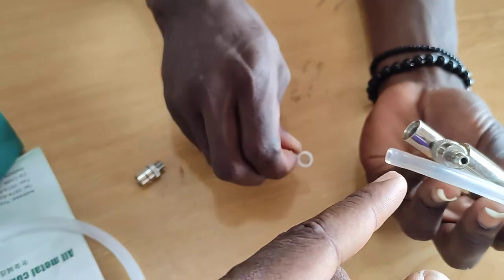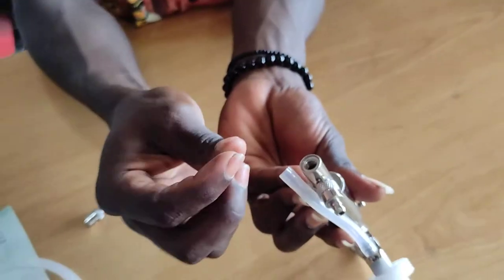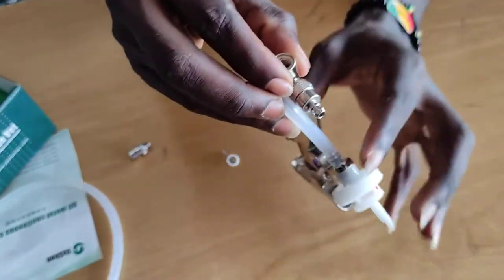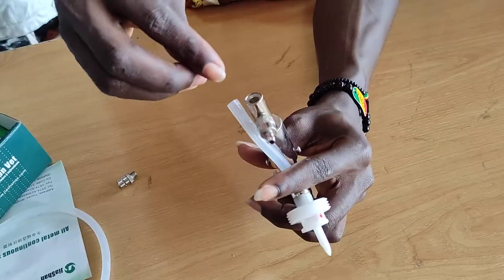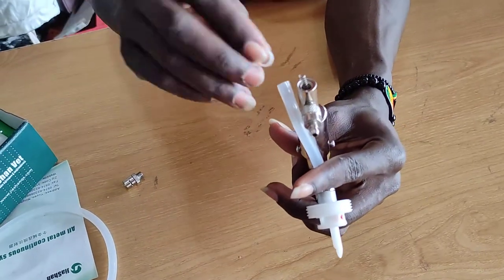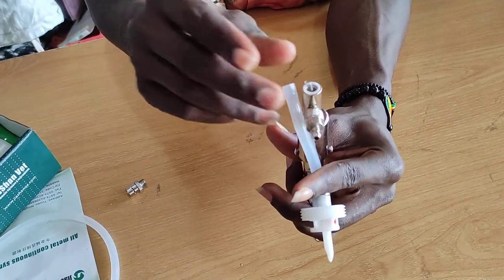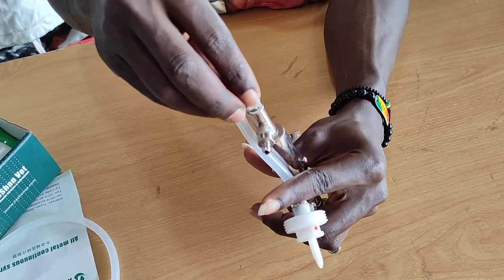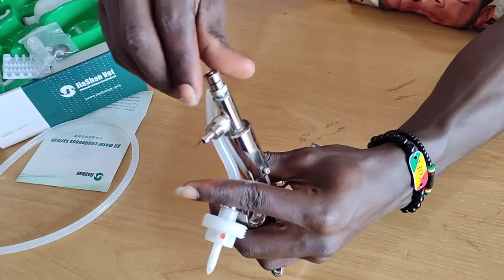This is how you assemble it. What goes in first? The ball goes in first, then the spring, then the seal, and then the cover. Then you screw it tight.